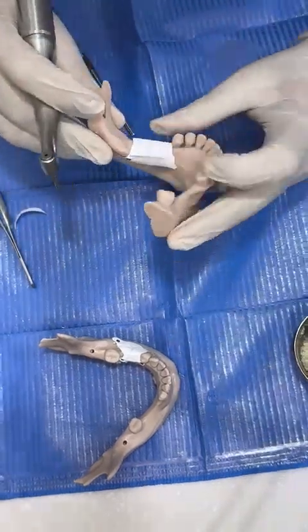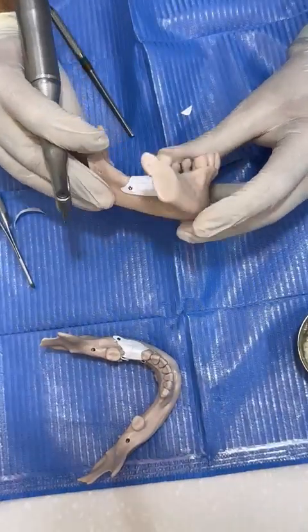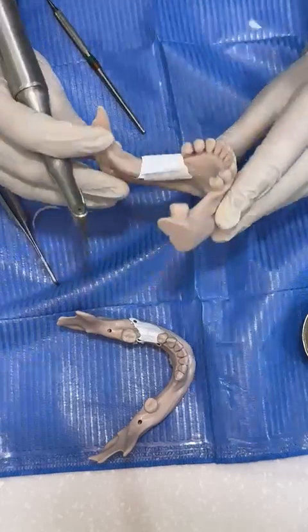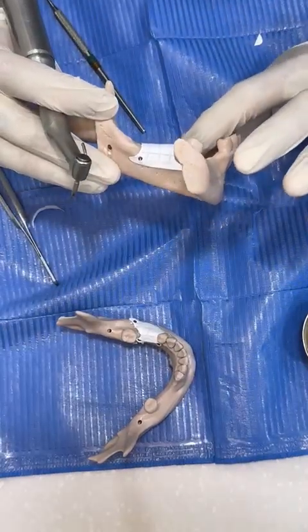Okay, this is the first screw. If you see everything in place, let's do the next one. The next one is not an easy one, it is here.